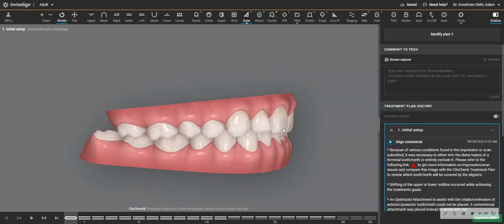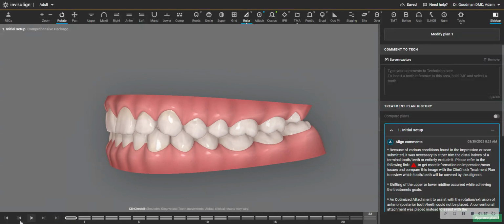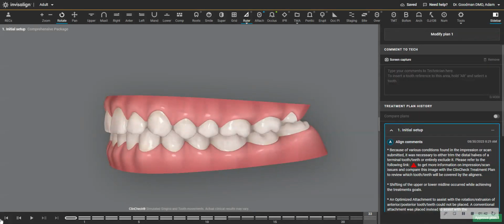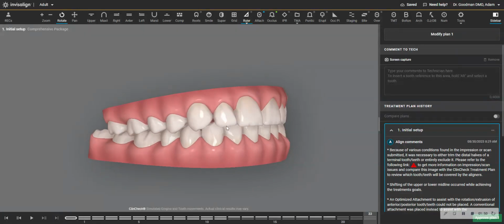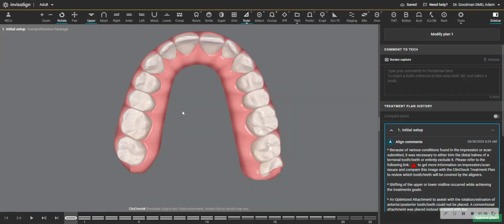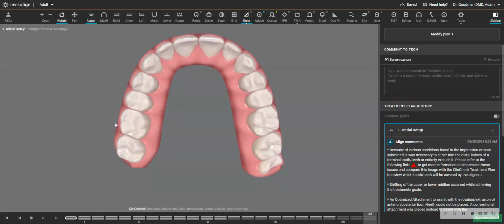But here's the mistake. Invisalign must have recognized that they wanted this patient to have nicer looking teeth in terms of the angulation. And this is what they provided. Now, if you look at this, that looks sort of more like what we want. And what's nice, at least seemingly nice, is that we got that inclination that we would like without opening up any space. So in other words, here's where the patient started, and here's where the teeth seemingly improved in terms of the angulation, and you see there's no increase in space.